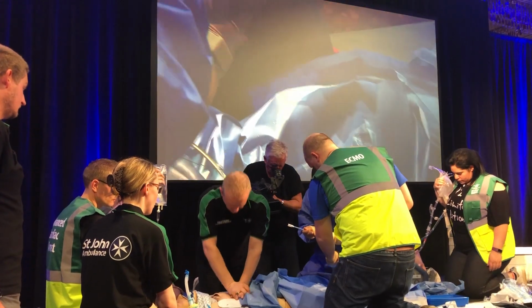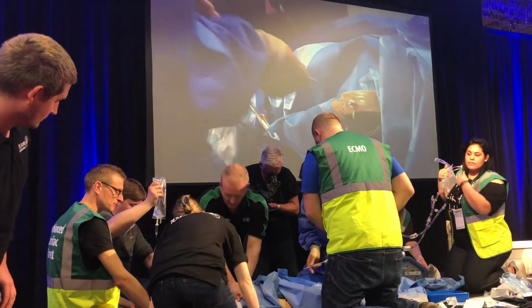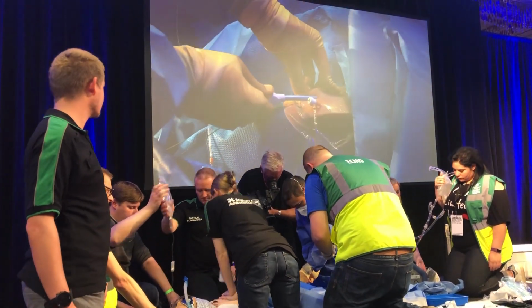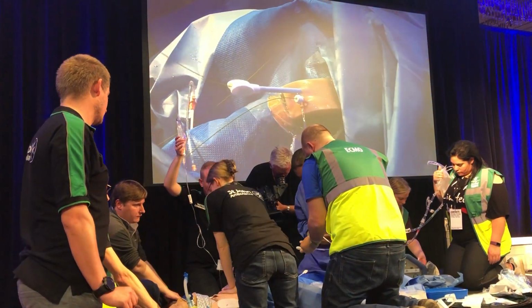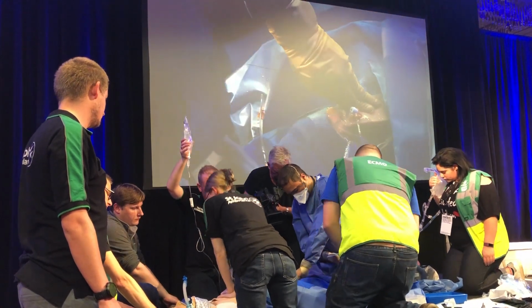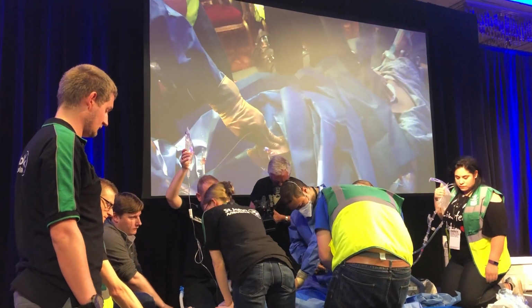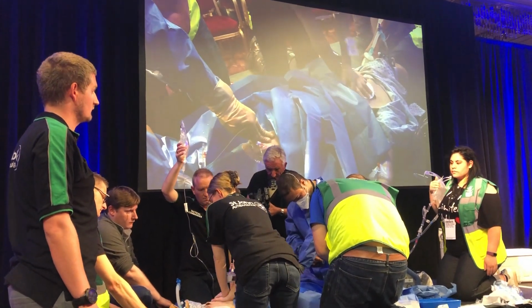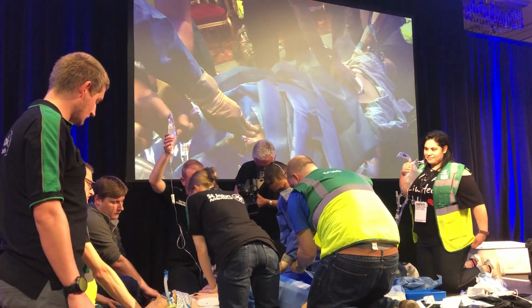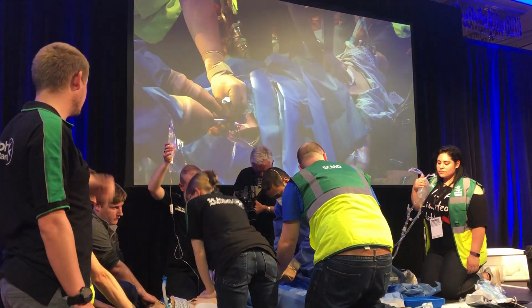So at this stage, the team is effectively serially going up on giant plastic things that make big holes. So this is where we can cause a little bit of damage if the wires aren't in the right place, but happily it doesn't happen very often. So it's not a no-risk procedure going into ECMO. It does carry with it some risk of problems. However, if you're at 20 minutes of cardiac arrest, which this patient is, then pretty much anything is a best interests intervention, because without it, your chance of survival, as we'll see, is 0.0 something with a normal brain, returning to a normal quality of life.